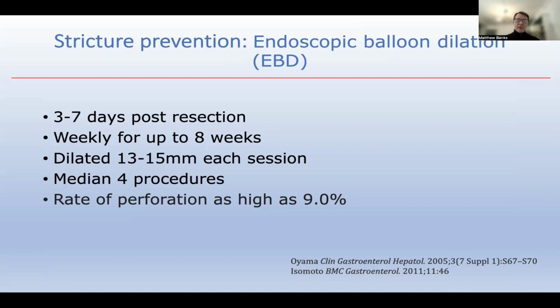With this technique, however, the rate of perforation is as high as 9% in the more complex strictures, and you need to obviously make the patient aware of this before you set about this technique.